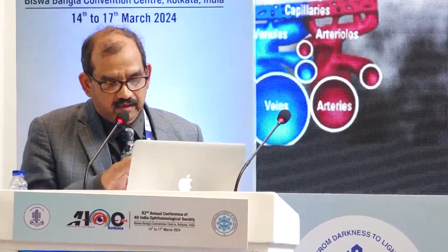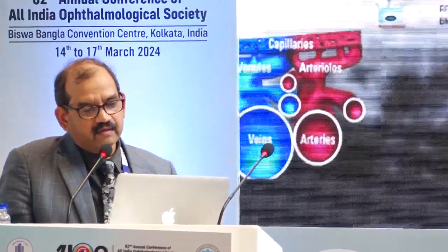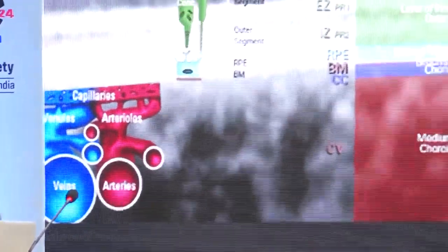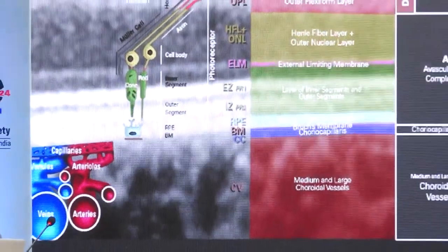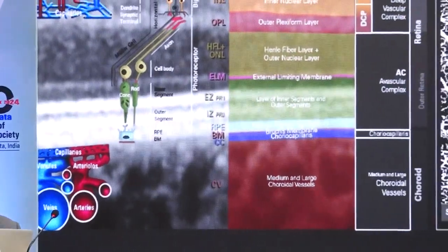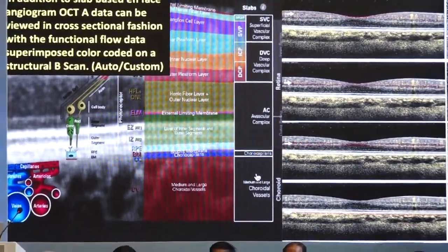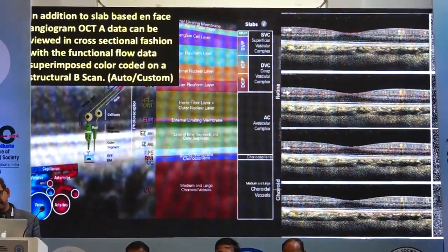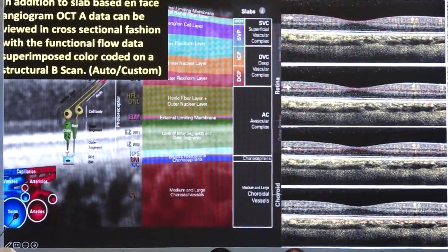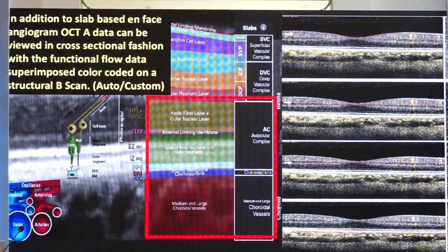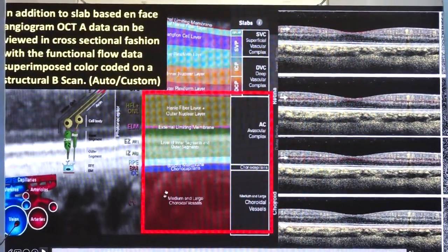This is just a small repetition of what Aminder and Dr. Ritesh have told, but on the left hand side there are cross sections of retinal layers and en-face maps of vascular patterns at different levels, developed in OCT angiography. In addition to the slab-based en-face angiogram, OCT data can also be viewed on the cross section. The yellow dots here — this is a Heidelberg machine where the flow is depicted in yellow dots — are the areas where the flow is present.